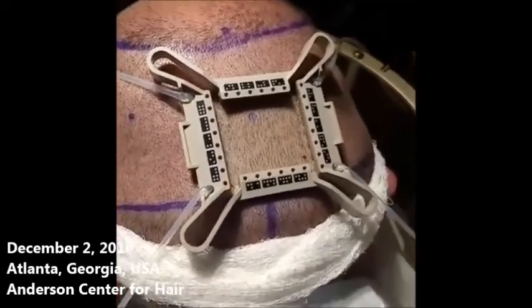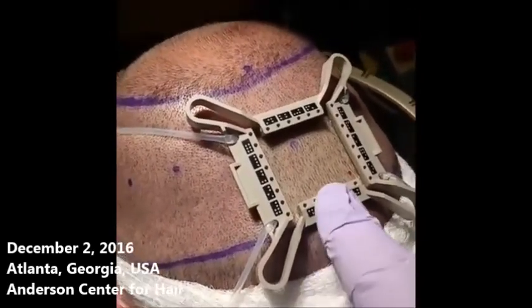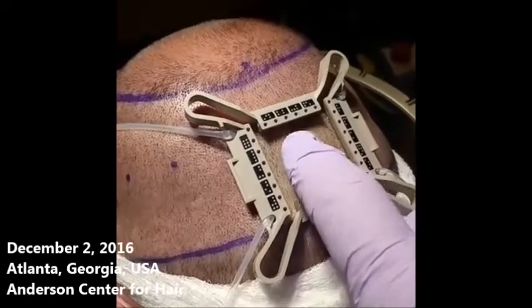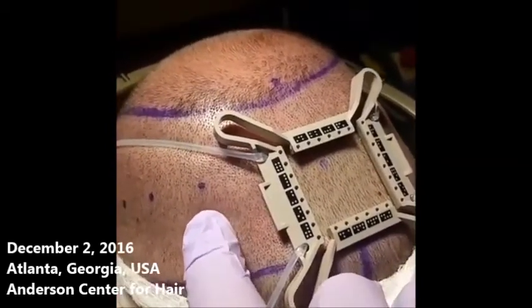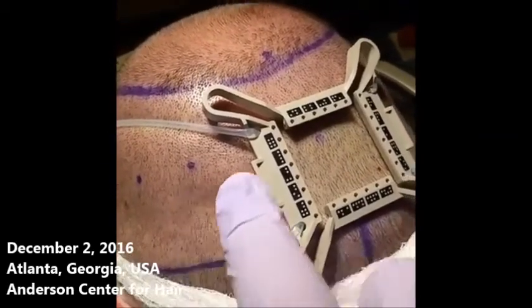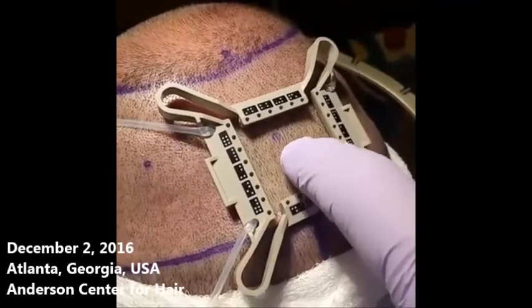That's a great view of the tensioner. You can see again the difference in the color of the skin inside — that's nice and firm, whereas outside is a little more spongy. You can even see the sponginess in the skin when I press on it, whereas inside, I'm pressing even harder and it doesn't move.